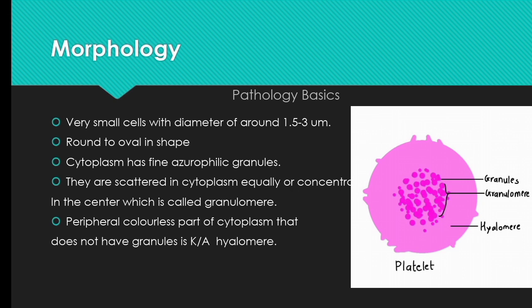Their cytoplasm contains fine azurophilic granules. In some platelets, granules are scattered in the cytoplasm, while in other types of platelets, granules are concentrated in the center. The central part containing granules is called the granulomere, and the peripheral colorless part of the cytoplasm that does not have granules is known as the hyalomere.